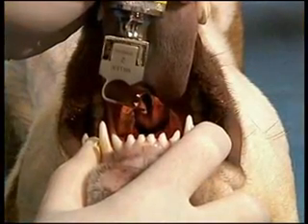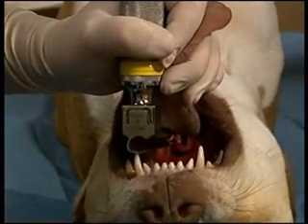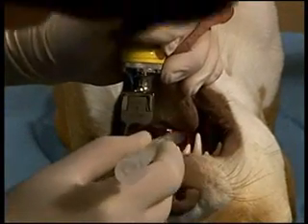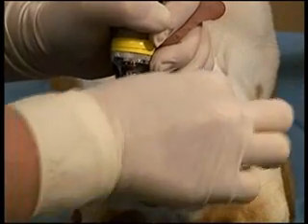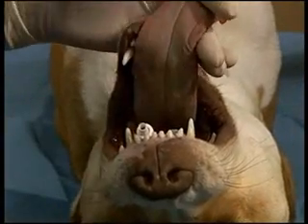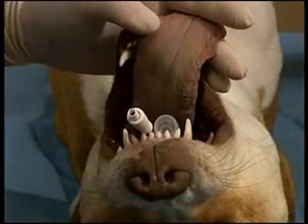Dorsal intubation can also be performed by a single individual. This allows the arytenoids to be easily visualized. The blade is placed over the epiglottis and braced on the hard palate or on the teeth. The arytenoids are visualized and the tube is inserted. A tube typically one size larger can be inserted using this technique than would be done if the patient was intubated in sternal recumbency.